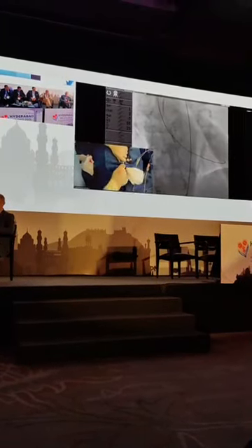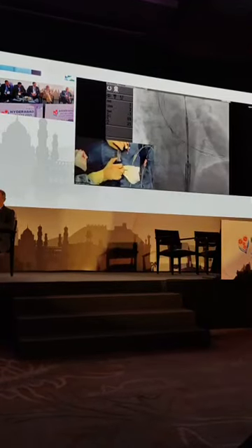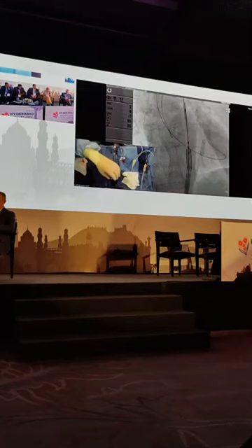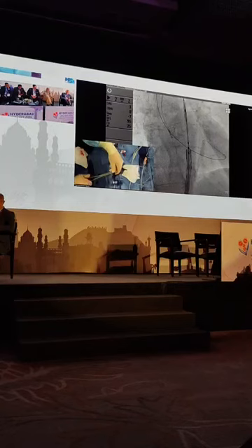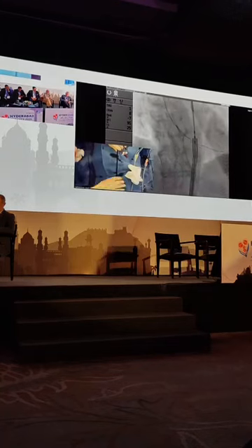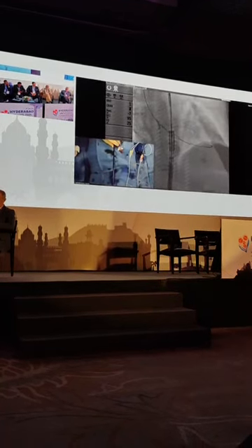And I have to exit from the sheath. I will pull back the loader. There is a loader which is placed when I introduce the delivery system in the sheath. It's better to remove it because sometimes when patients are tall, the catheter is too short. So Christophe will do the alignment.